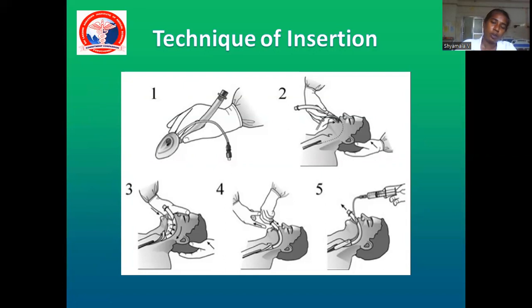Then put the patient in supine position. Just hold the neck. No need to put them in head tilt or chin lift. Jaw thrust is not needed. Just put the patient in a lying down position. Hold the head. It should not roll.